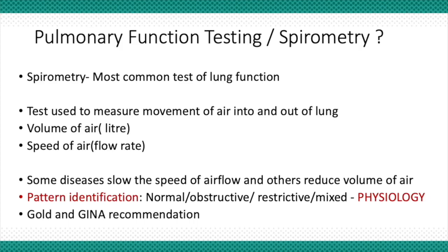So pulmonary function testing, or spirometry, is something that all of us as pulmonary physicians perform as one of the most common tests of lung function. We use this test to measure the airflow into and out of the lung, and we are assessing not only the volume of air that's entering but also the speed of air.